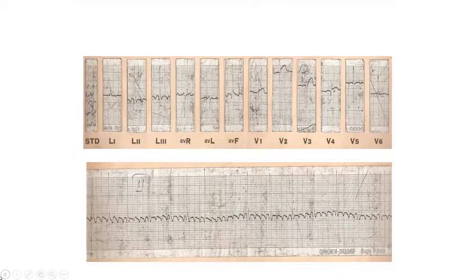Any other cause? I think these are a few examples of irregular rhythm: atrial fibrillation, atrial flutter with varying block, multiple ectopics, atrial or ventricular, chaotic atrial rhythm, wandering pacemaker, and multifocal atrial tachycardia. These are all examples of irregular rhythm. But anytime you find a patient with irregular rhythm, always go for atrial fibrillation. Only if the examiner asks about the differential diagnosis should you discuss it. Always your diagnosis in a patient with irregular rhythm is atrial fibrillation. And then the electrocardiogram can definitely differentiate between atrial fibrillation and other arrhythmias.